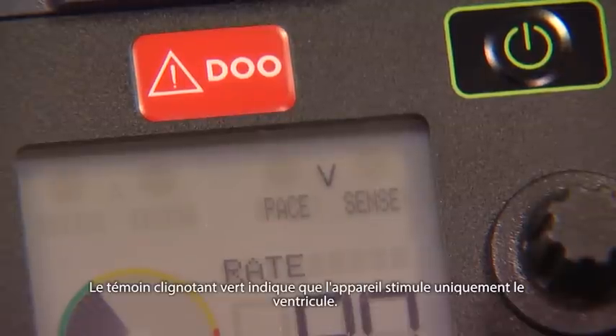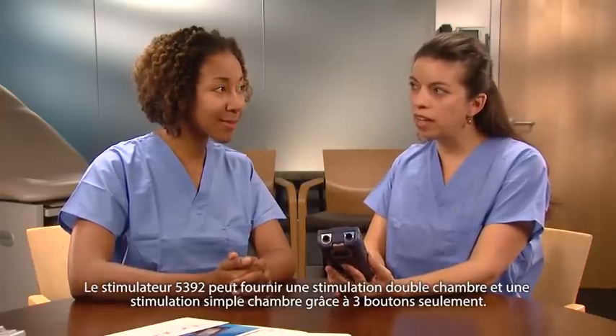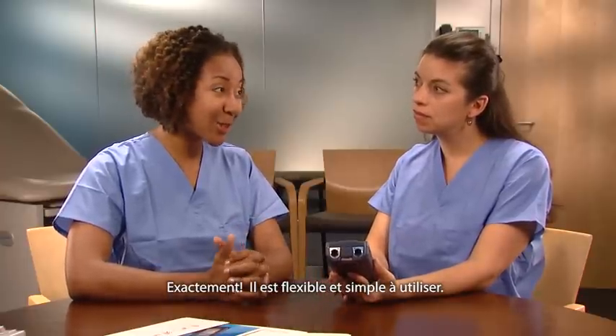I see by the green flashing light that the device is pacing just in the ventricle. That's right. So the 5392 can provide single as well as dual chamber support with just three dials. It really is flexible and simple to use.